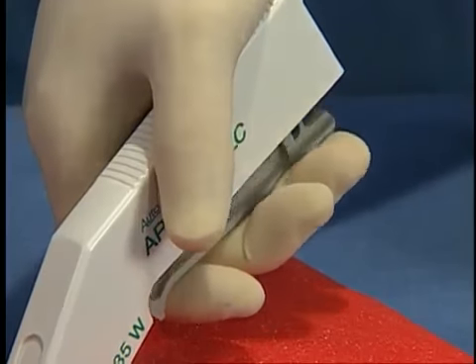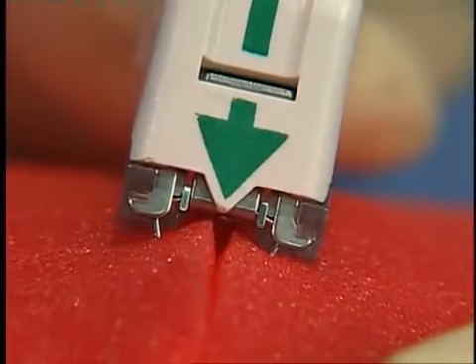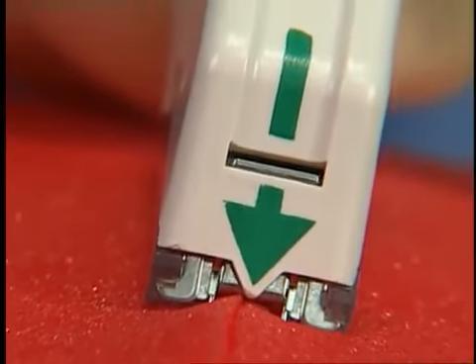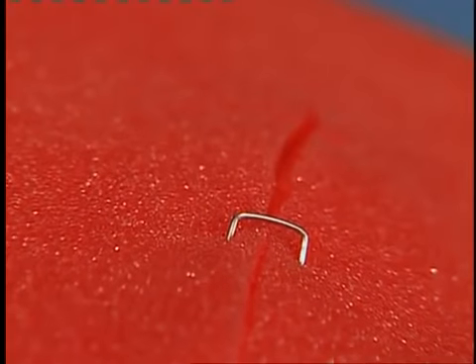Release the handle completely after squeezing and remove the stapler. Each time the handle is squeezed, it places a single staple. The staple first penetrates the skin and is then formed, thus holding the tissue together.